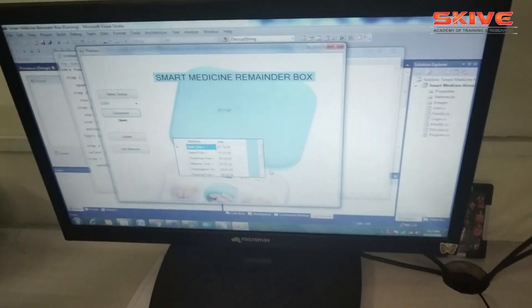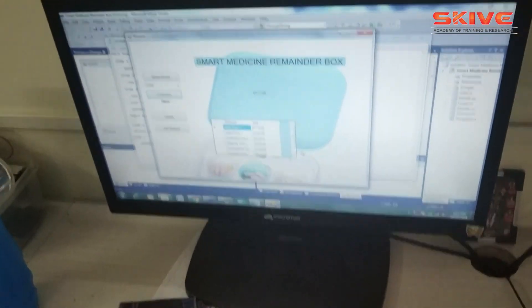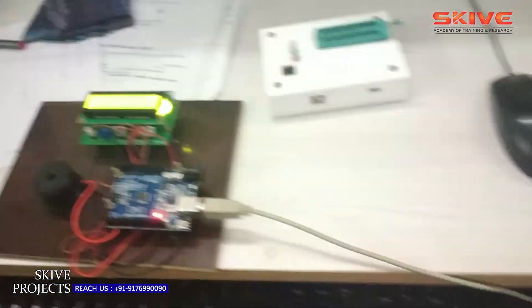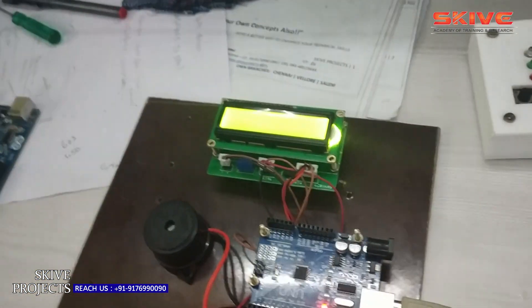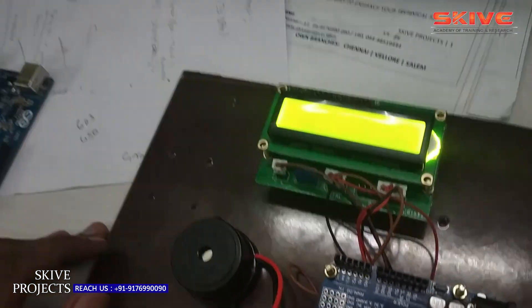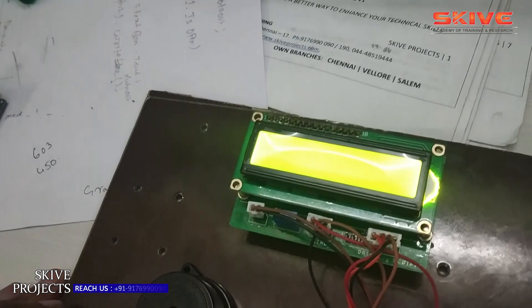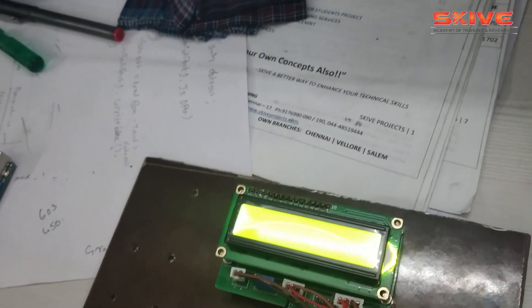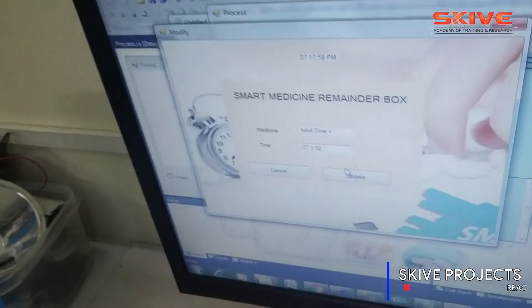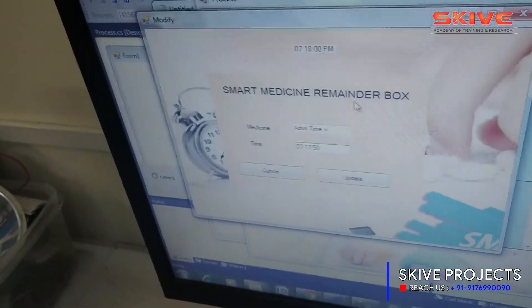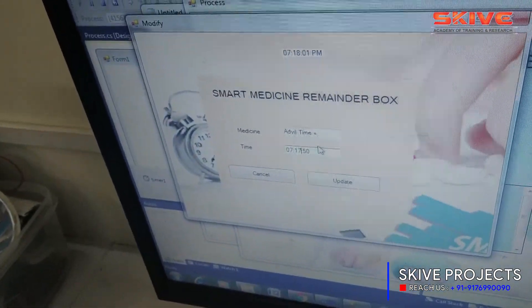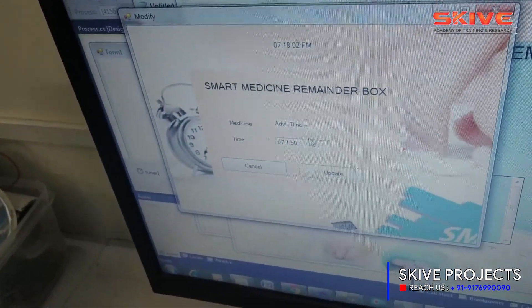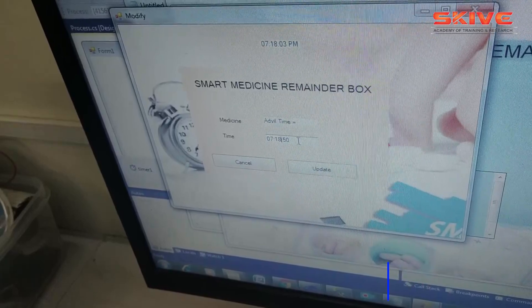On the hardware side, it will give a reminder at the particular time and show what medicines need to be taken. This concept can also be integrated through IoT, where you can set up the medicine name and time in the IoT software part.